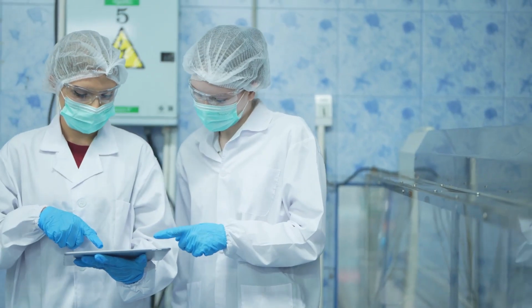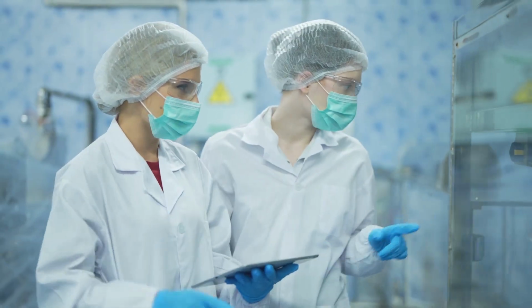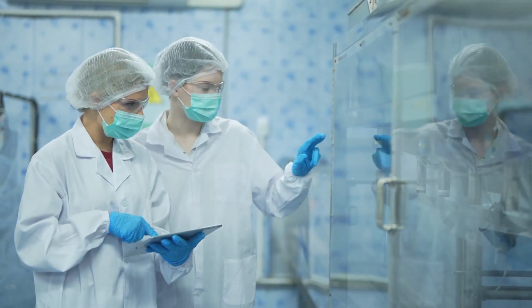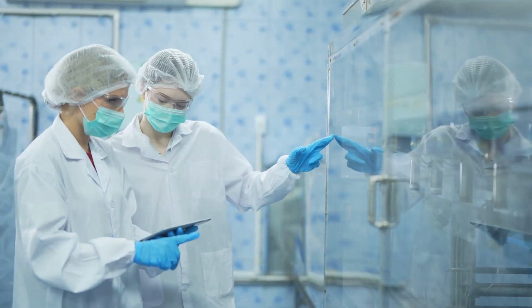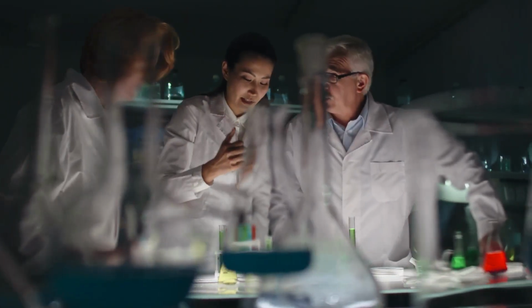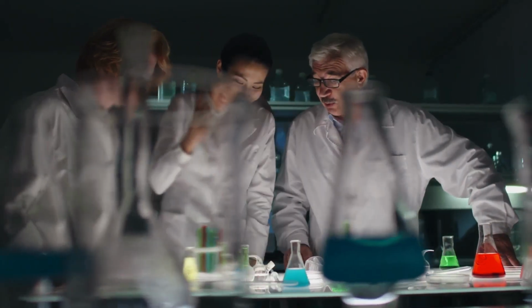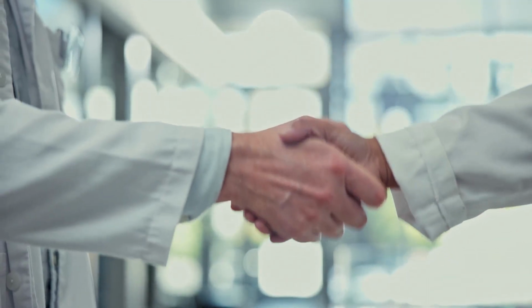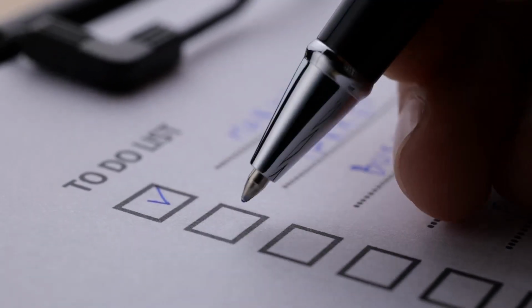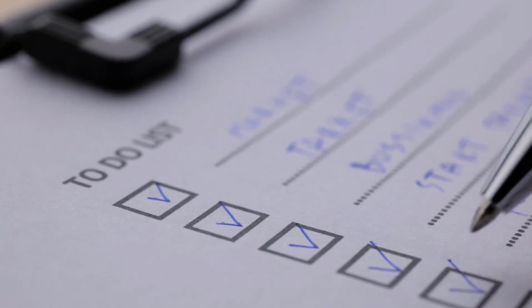It is the responsibility of the medical device manufacturer to facilitate performance of this testing, which may be outsourced. If a contracted supplier, like a contract manufacturer or the contract sterilizer, is to perform this testing on behalf of the medical device manufacturer, it is imperative to ensure that this is defined in an executed quality agreement or other similar agreement or contract.